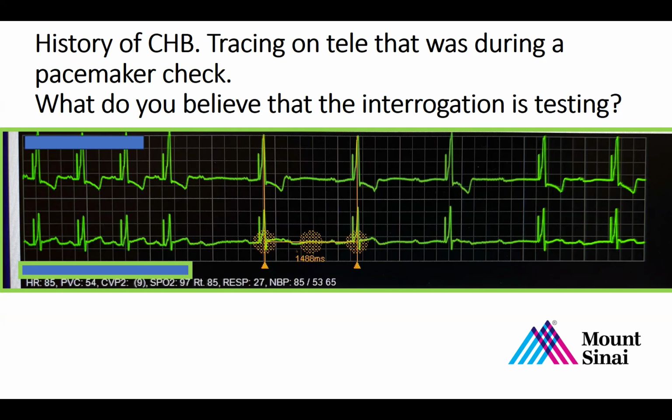But the last thing you really want to do in somebody who just had a pacemaker, particularly if it's a big surgery, is to make them faint in bed because you have a heart rate of 12. That doesn't look very good, not so good for the patient. So generally speaking, if I was doing this test, I would allow 3 to 5 beats, and then if it wasn't sensing, just go right back to pacing on the assumption that the underlying rate is just too slow to test. Any questions about this?